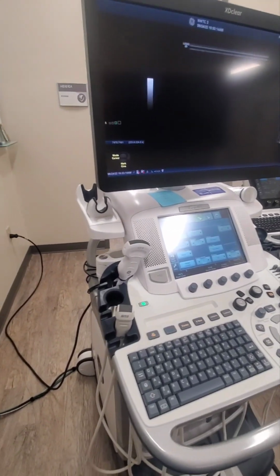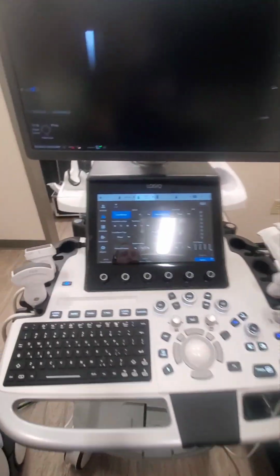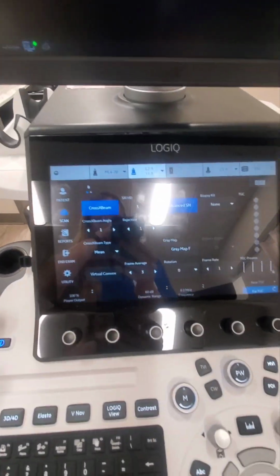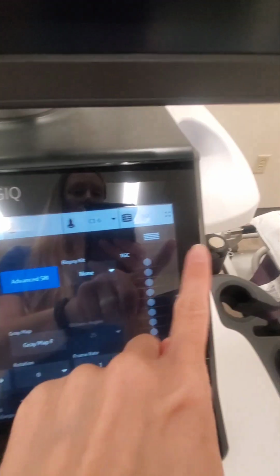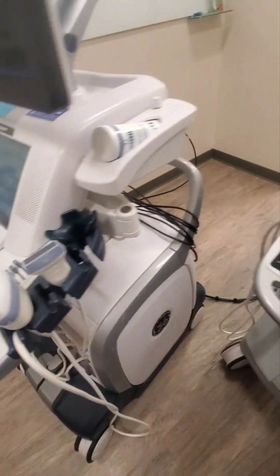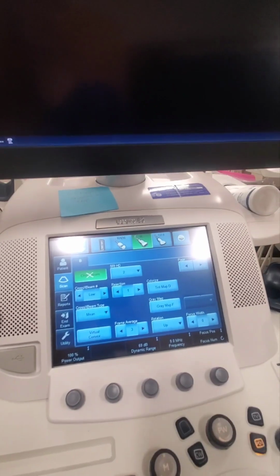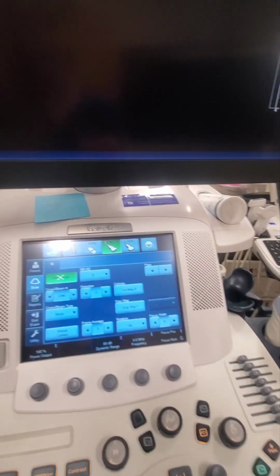All right, so those are the transducers on the machines. If you need to unplug and plug in a transducer, you can see the machine selections here. And I'm sorry for my reflection back there and all the lights reflecting that glare. I'm sure that it's going to impede the quality of the video that you're trying to watch. I apologize that this is not high tech, but this is what we got.